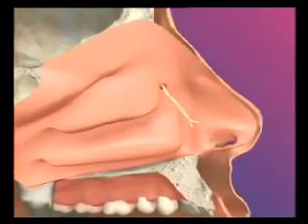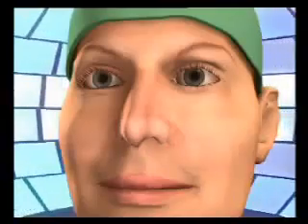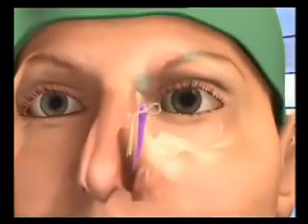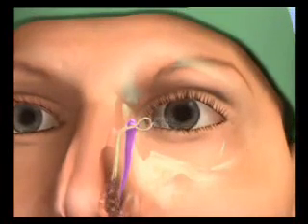The mean surgery time is 10 minutes. The intubation is withdrawn after 1 month. Transcanalicular and endonasal laser-assisted dacryocysto-rhinostomy offers a series of advantages. It does not leave a skin scar.